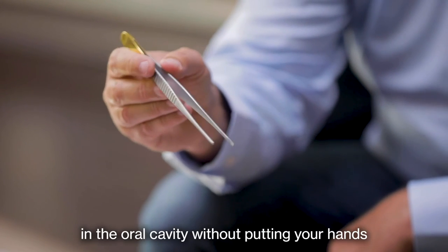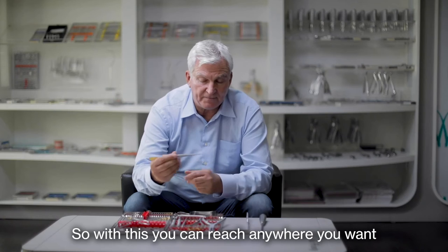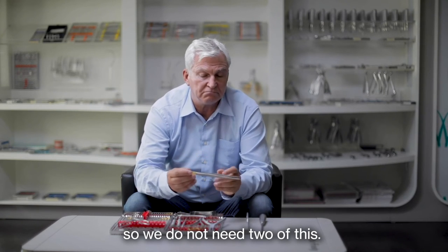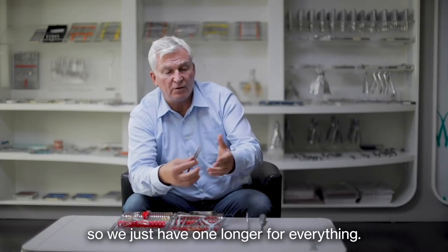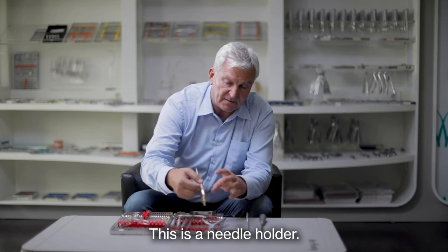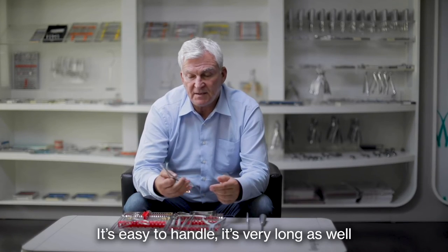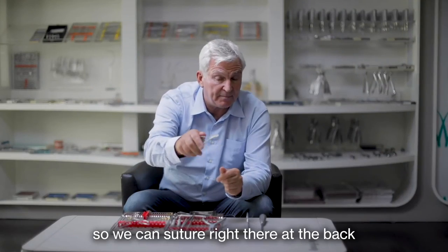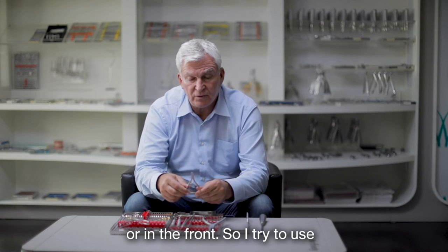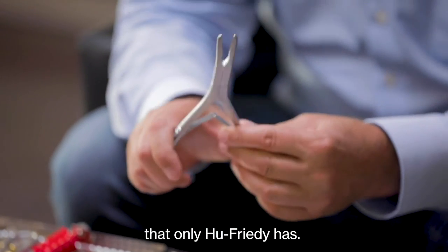On this cassette, the tweezers are a little bit long. The reason is that we can reach deep into the oral cavity without putting your hands inside the mouth — with this you can reach anywhere you want. Some people like them small, but to do wisdom teeth or zygomas you need them longer, so we just go longer for everything. This is a needle holder — I particularly like this one; it's easy to handle and it's long as well, so we can suture at the back or in the front. The goal is to use one instrument for different occasions.